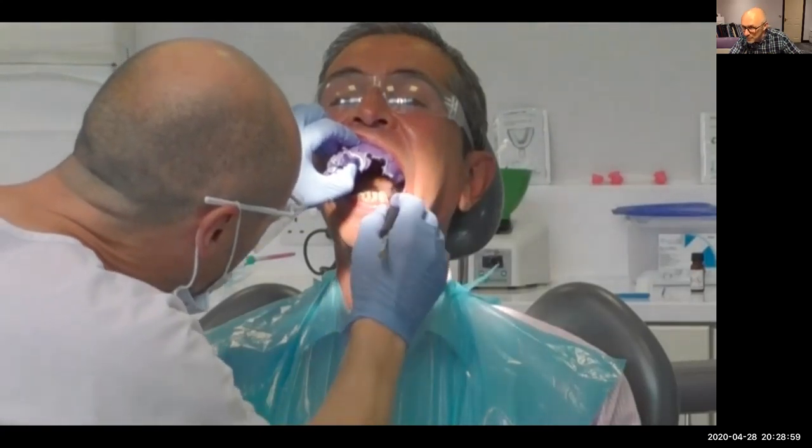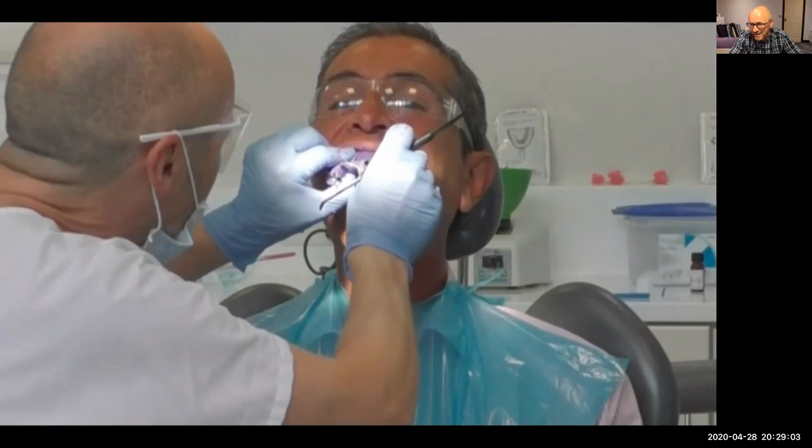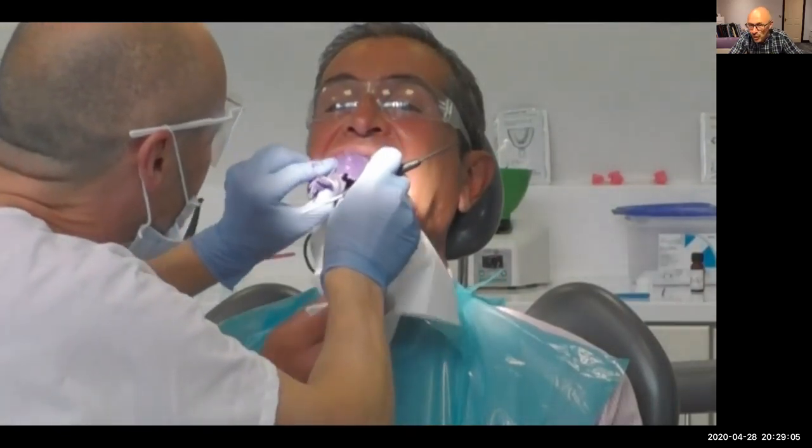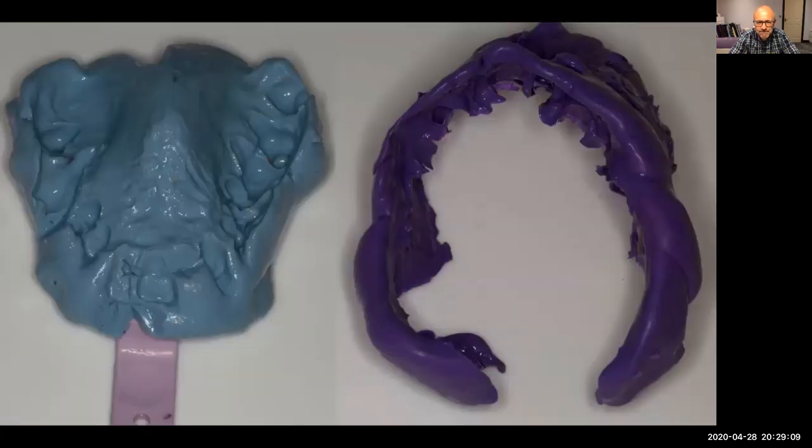And doesn't it look a mess at this moment? It looks really untidy. But don't worry, it all fits into place. So we have these two parts here. So we've got the alginate and the silicone.